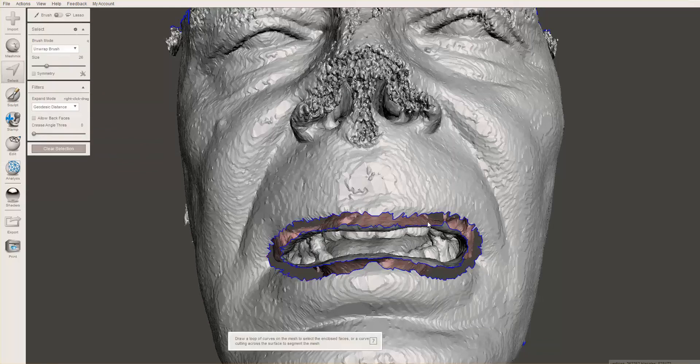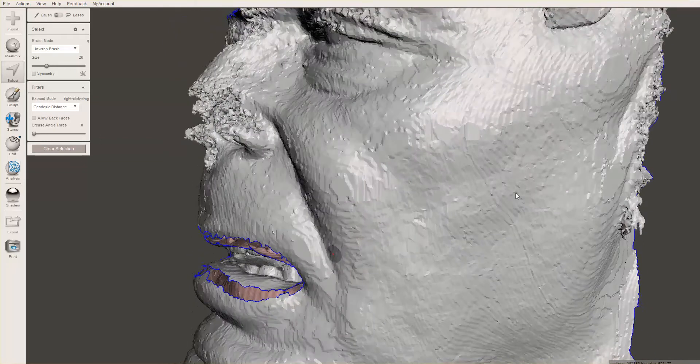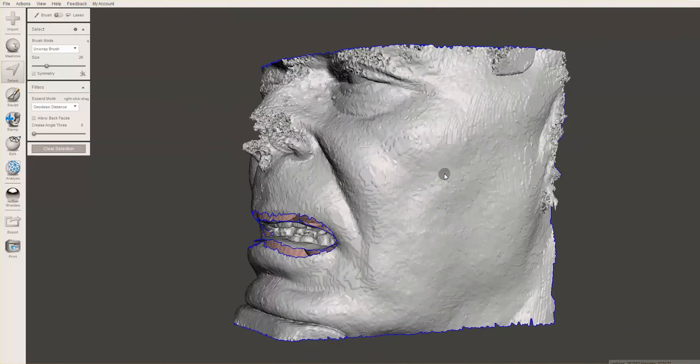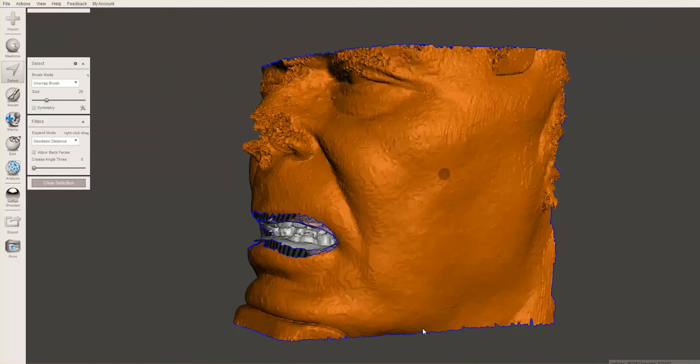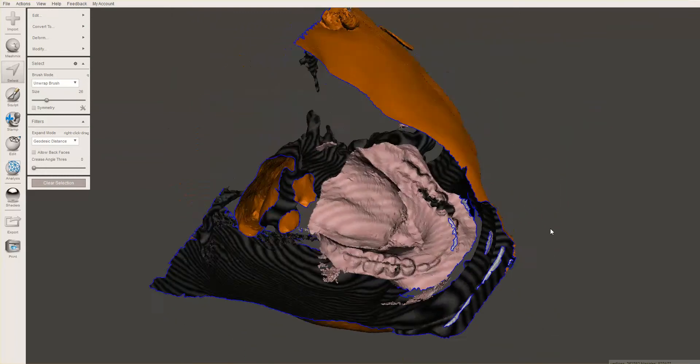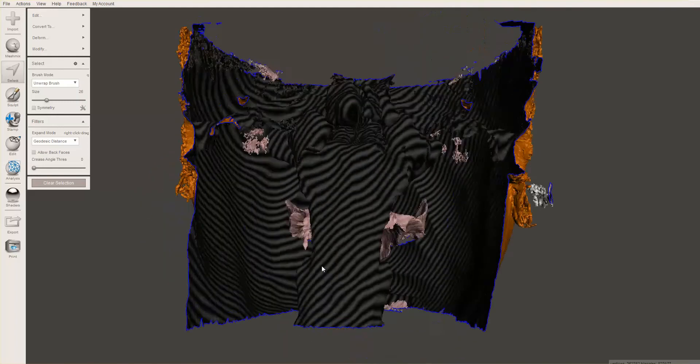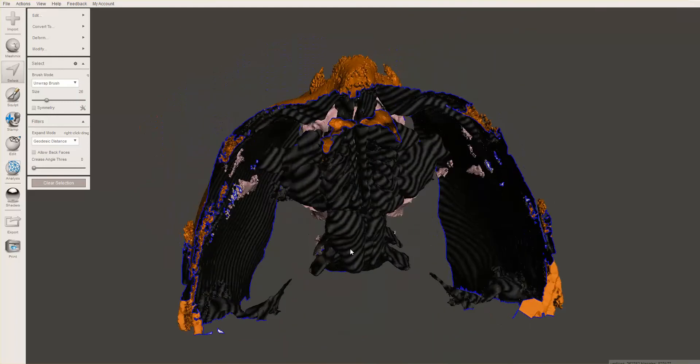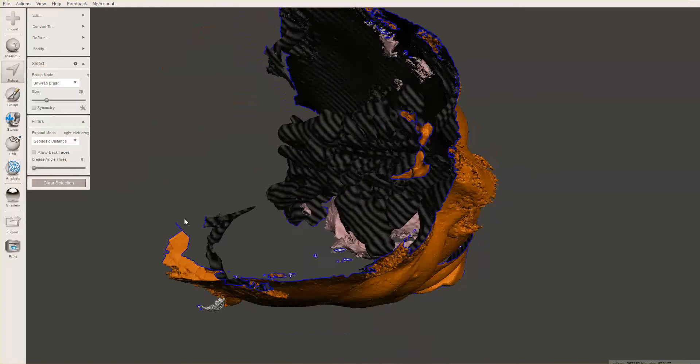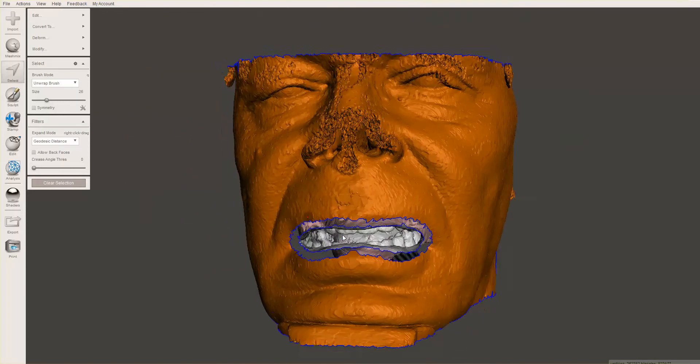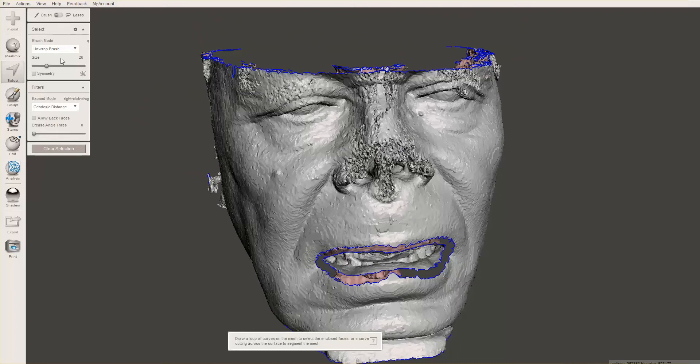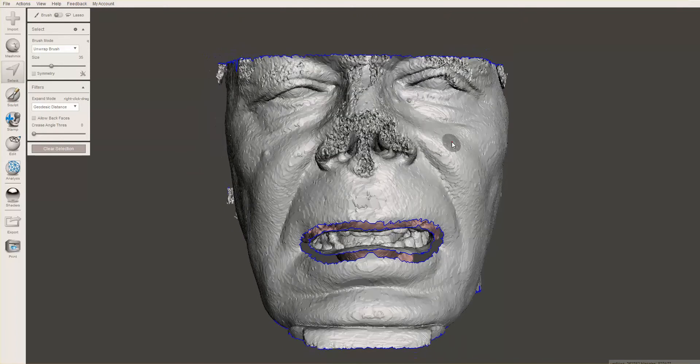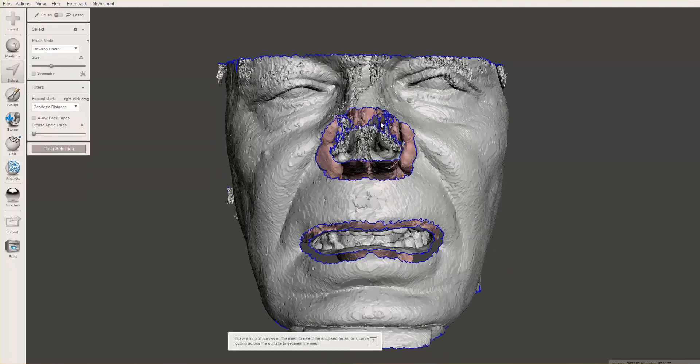And now if I delete that, now there should be two independent shells here. And we'll know if I can click this and it selects it all, but it does not select the inside, which you see there. And also I'm going to, I don't want to select this yet. So I'm going to push. Where is that connecting? It's got to be somewhere in the nose. Okay, so let's do the same thing with the nose real quick. I select, I'm going to make the brush size bigger, and I'm going to outline the nose. And delete.